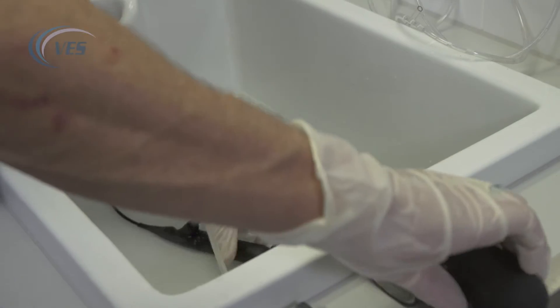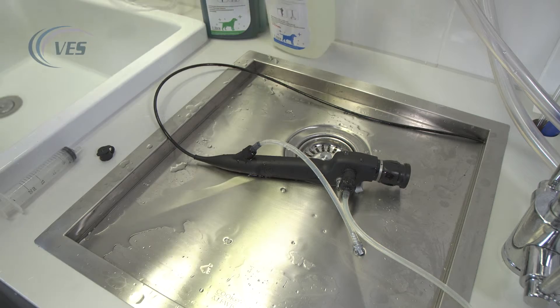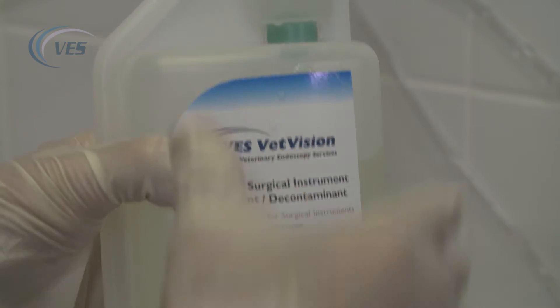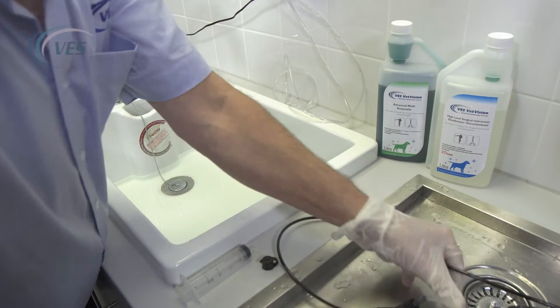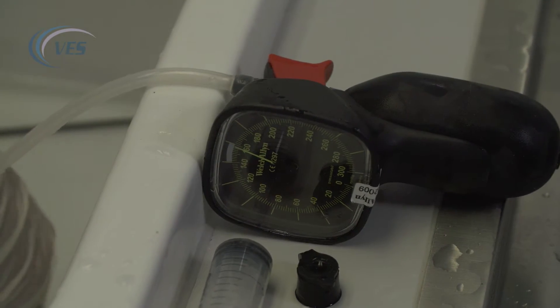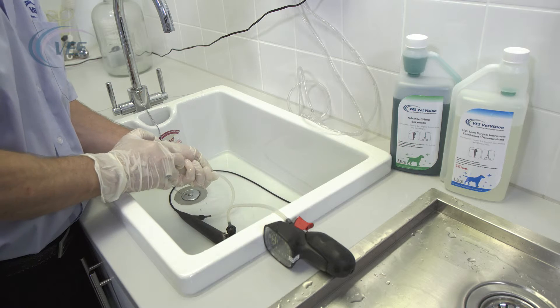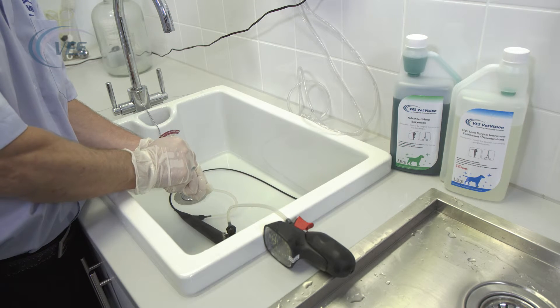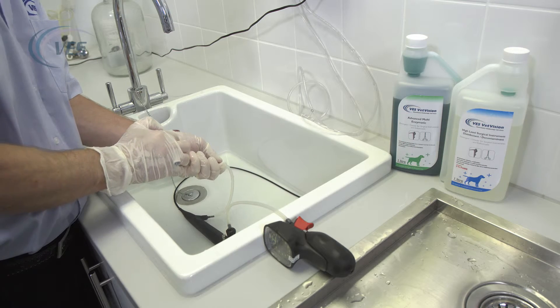We would then remove the scope from the Enzymatic and rinse it off with cold water. We will then mix up our disinfectant and again follow your manufacturer's guidelines for the dilution rates and timing. We follow the same procedures as before — make sure the leak tester is kept outside of the chemistry, place the scope in the disinfectant, and simply flush through two or three times to make sure we flush out any Enzymatic that's inside the scope. Our chemistry recommends 10 minutes and that's fine.